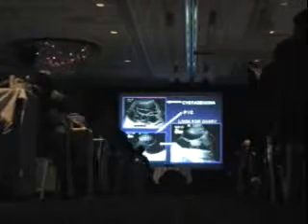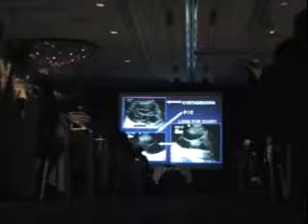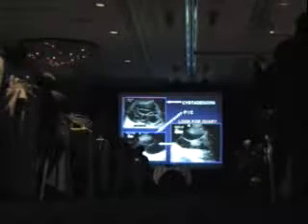And then, looking further at this woman, we were able to find her ovary. If I couldn't find her ovary, I would get an MRI looking for her ovary, because the last thing I want to do is say, I'm worried in this woman that this could be a neoplasm, which would start spinning the wheel, ending up in surgery. It would be tough surgery because she's already got adhesions, and what will happen? She'll get more adhesions. A lot of these women end up with bowel obstruction, so you want your hands off these women if you can, based on the history, finding the ovary and noticing it's really relatively passive fluid.